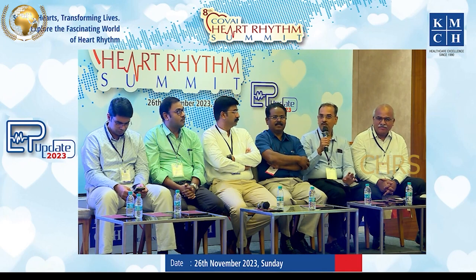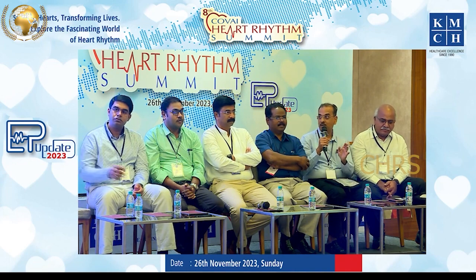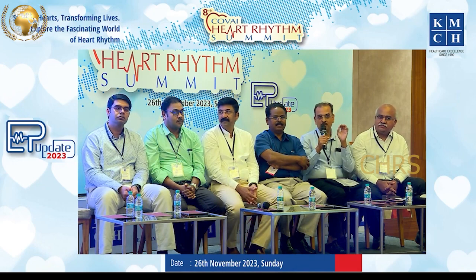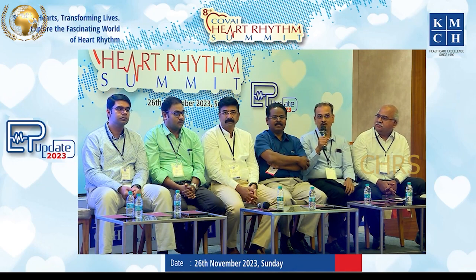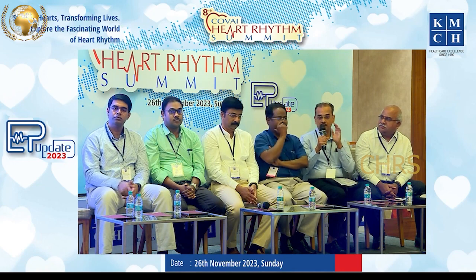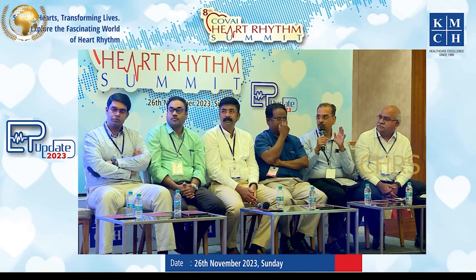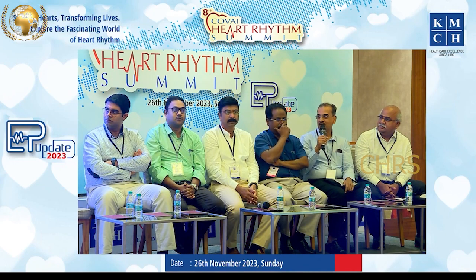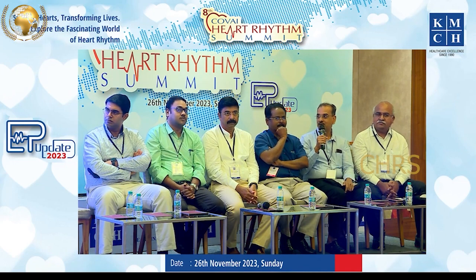Many a time we have seen classical chest pain with the ECG normal for 24 hours, 48 hours, and then suddenly a change comes. The important thing is always compare a previous ECG with the present ECG for any changes going on, acute coronary syndrome, especially when the ECG is normal and the patient has got a classical pain, you have to rule out left main. Sudden death is really associated with it, so we have to keep a watch on that.